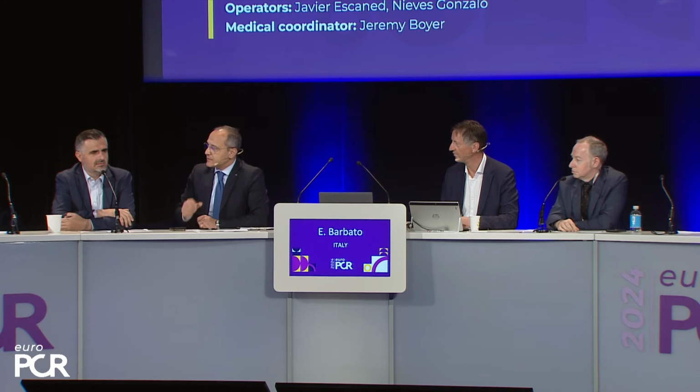What is your reasoning? Maybe just, I would not do CT. I think if you have OCT, you don't need CT. But that's my opinion. The challenge is, I think the important things are two. We need to get enough lumen in this ostial circumflex, because that's really the key of why we do this. And second, I don't want to lose any side branch, and I would love not to end up in a two-stent strategy. So these are my thoughts at the moment.